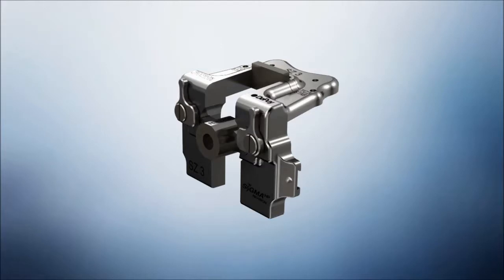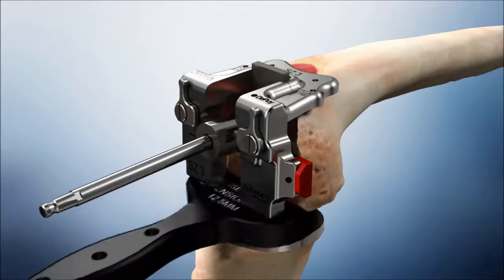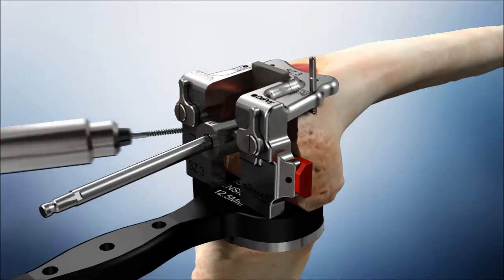Lock into place by rotating the tabs anteriorly to the stop. If distal augments were prepared for, slide the distal spacer into the corresponding side of the revision notch guide. Slide the notch guide onto the removable shaft and advance to the prepared distal surface. The HP Revision MBT spacer block may be used to assist in re-establishing the rotation of the notch guide. Pin the notch guide using non-headed pins.